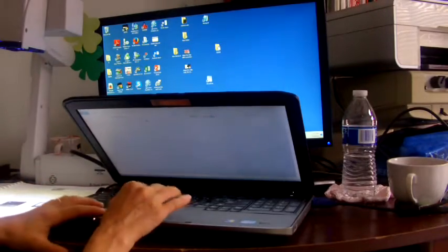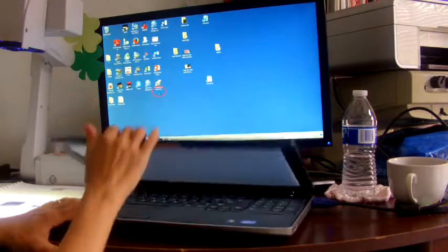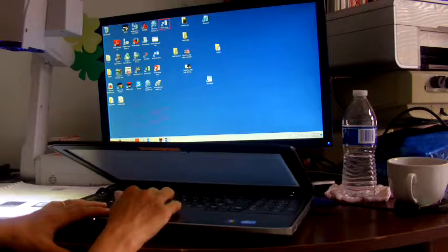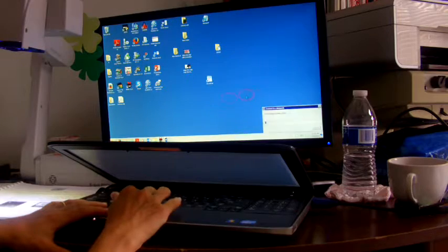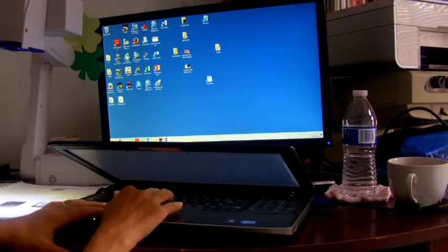Now usually if I was doing this in real time for an assignment, I'd be having my monitor spaced differently, but I did this so you could see it in the same view with the video. I'm going to connect my eBot. Okay, so we're going to open the eBot.